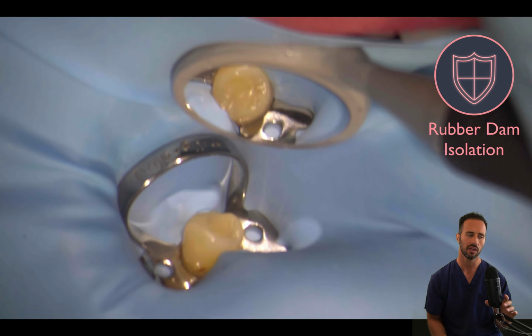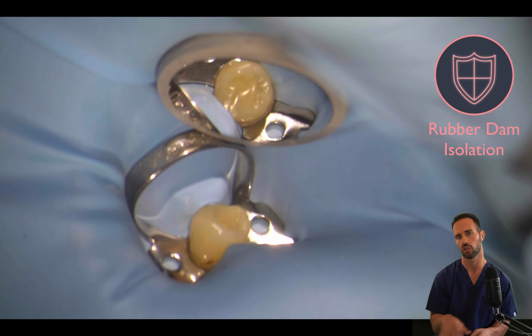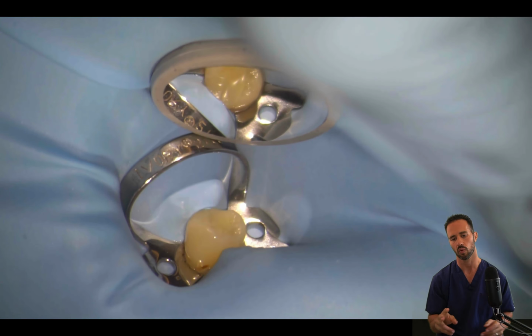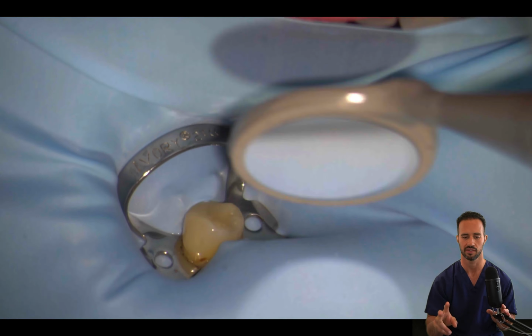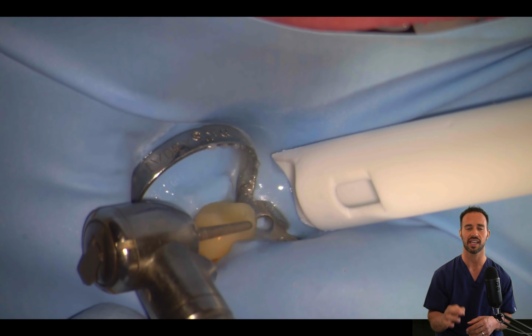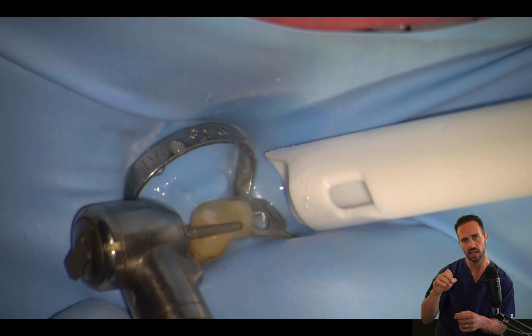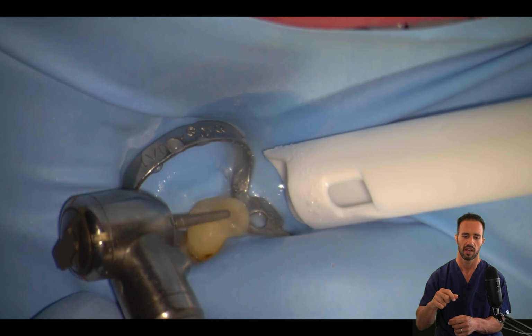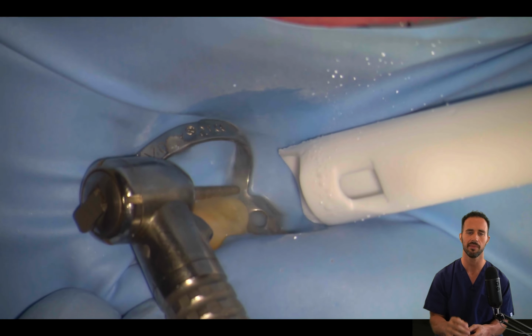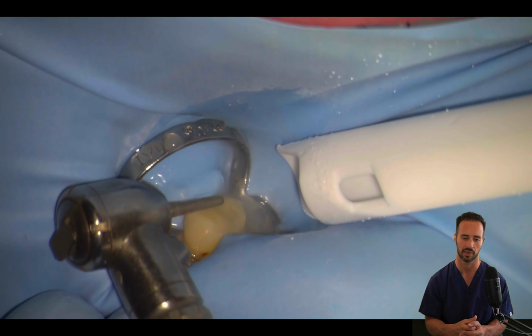And when you're doing root canal treatments in general, it's a great idea to lower the occlusion on the teeth that you're working on. Okay, that's really important for 2 main reasons. So for number 1, you want to have a really stable reference point for your instrumentation, because the rubber stopper on your rotary files needs to be ending at a very precise location every time, so that you know that you're actually instrumenting to the length that you think you're instrumenting to.